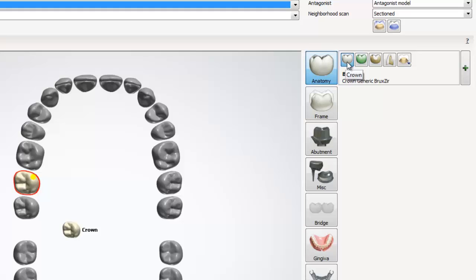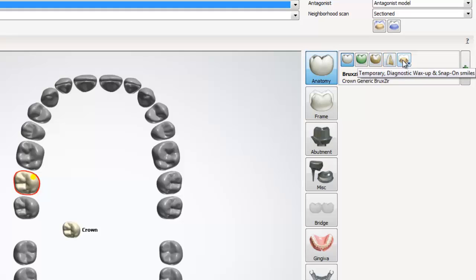We will use this when we are creating a full contour restoration, whether it be wax, zirconia, etc. The next option is the crown pontic, which we can use when designing a bridge. After pontic, we have the inlay, the onlay slash veneer, and the temporary, diagnostic wax up and snap on smiles options.